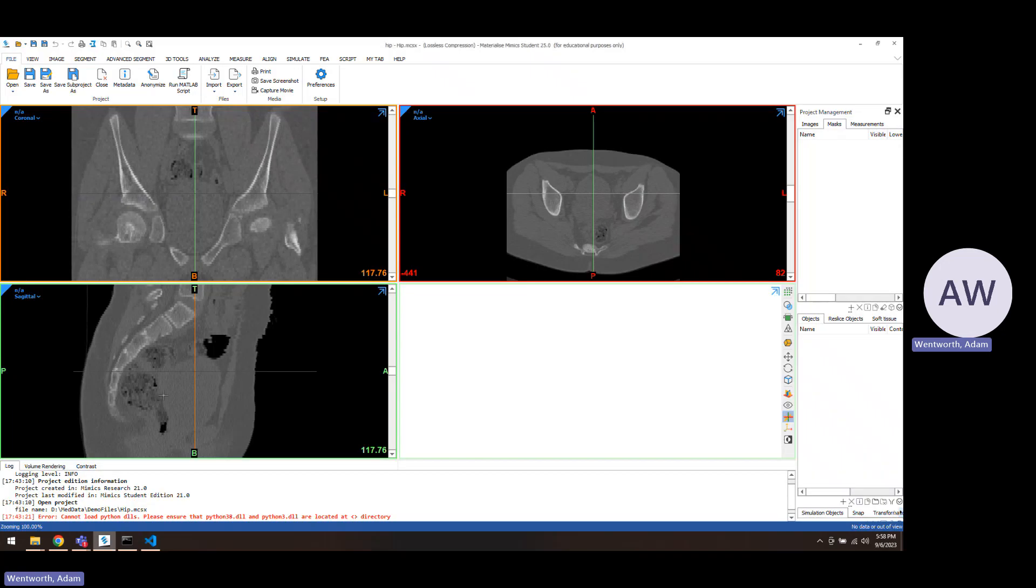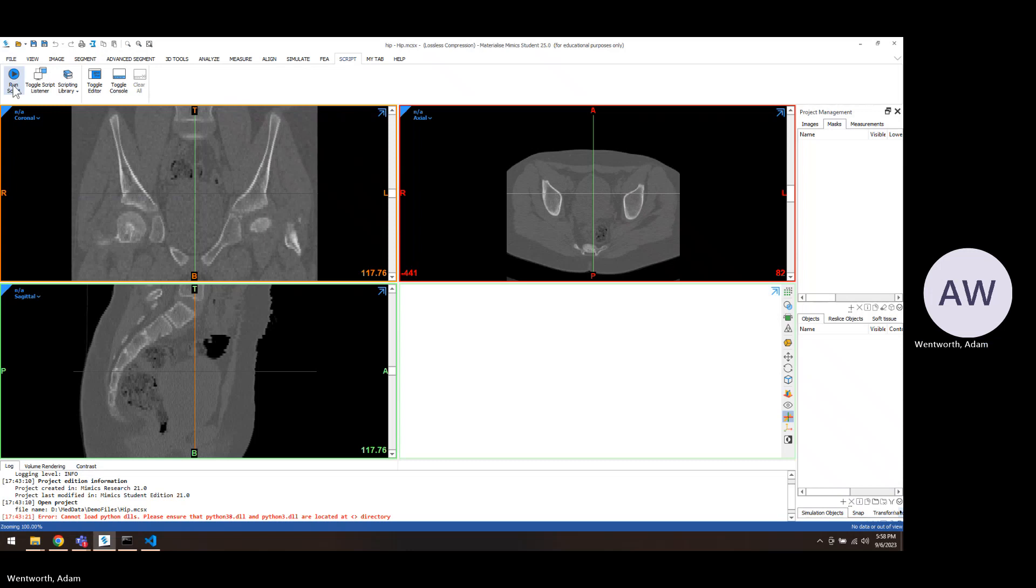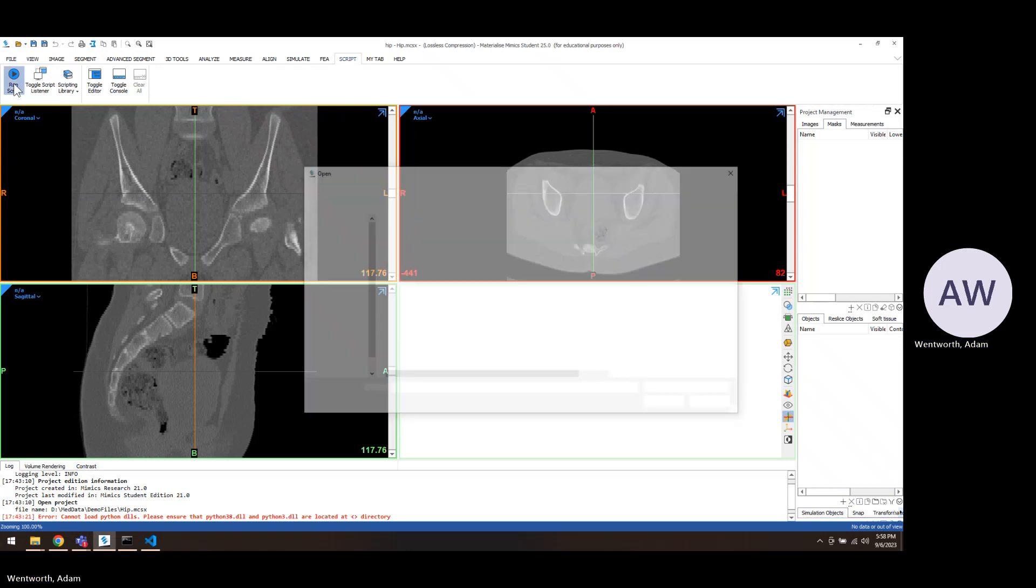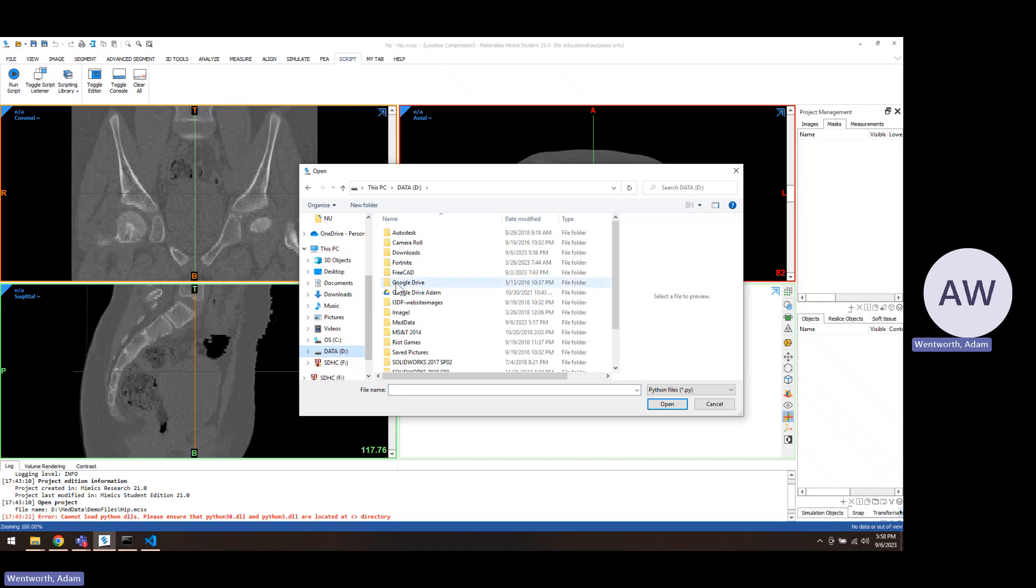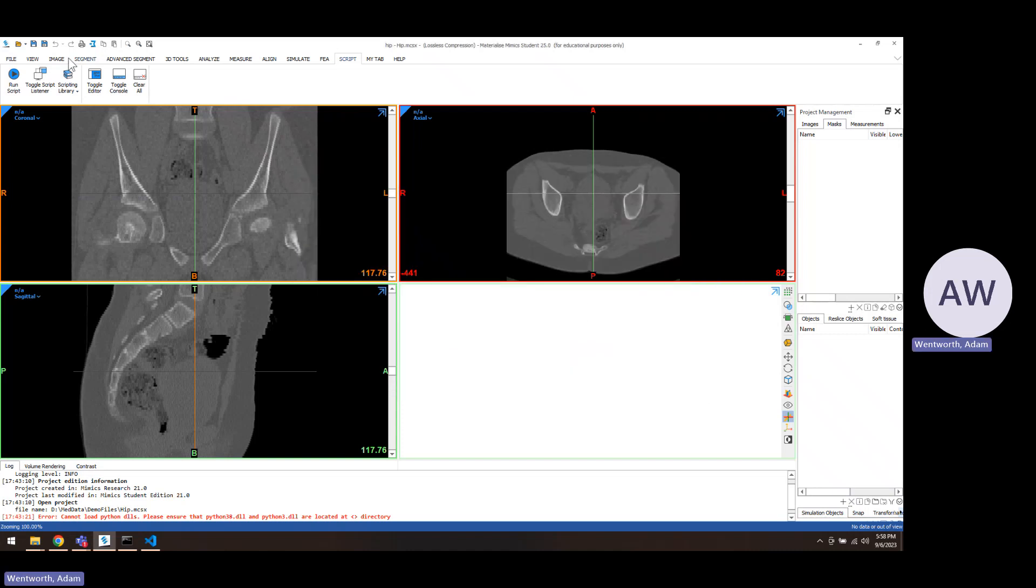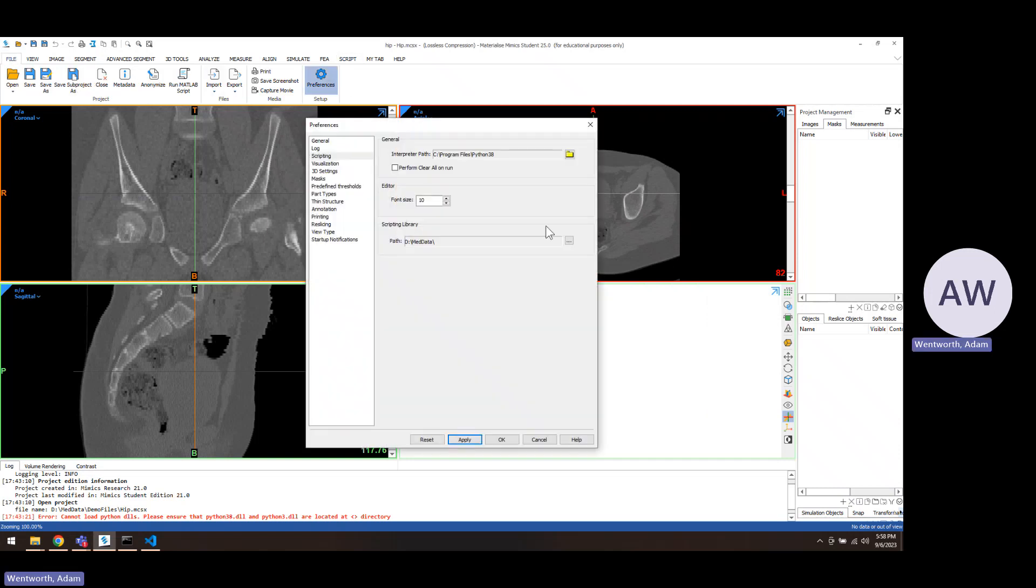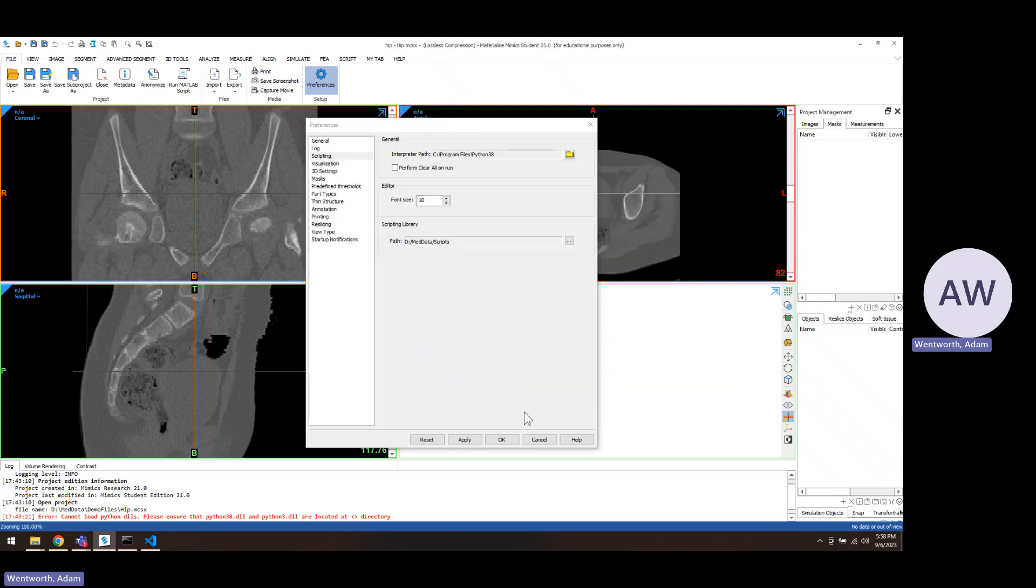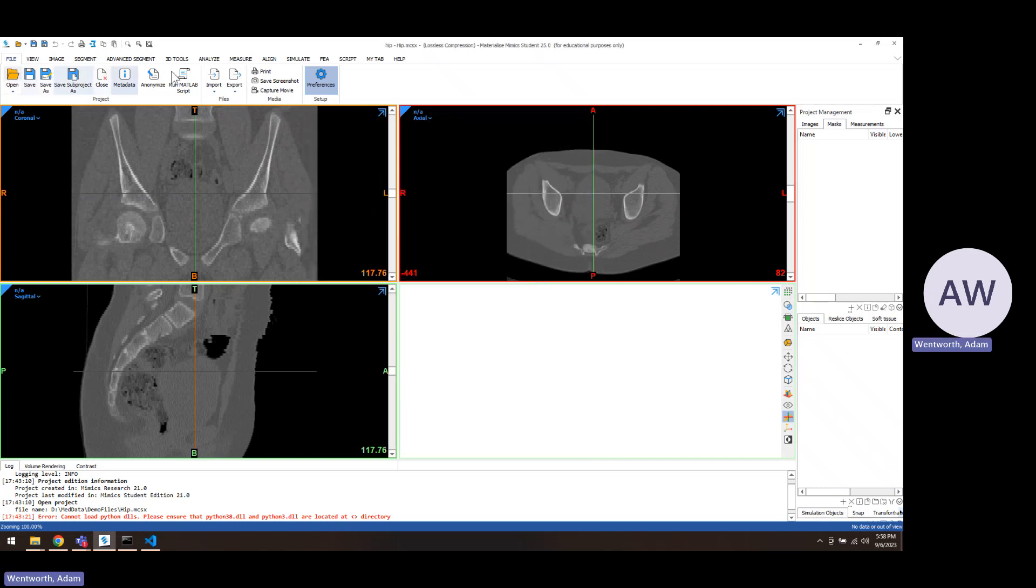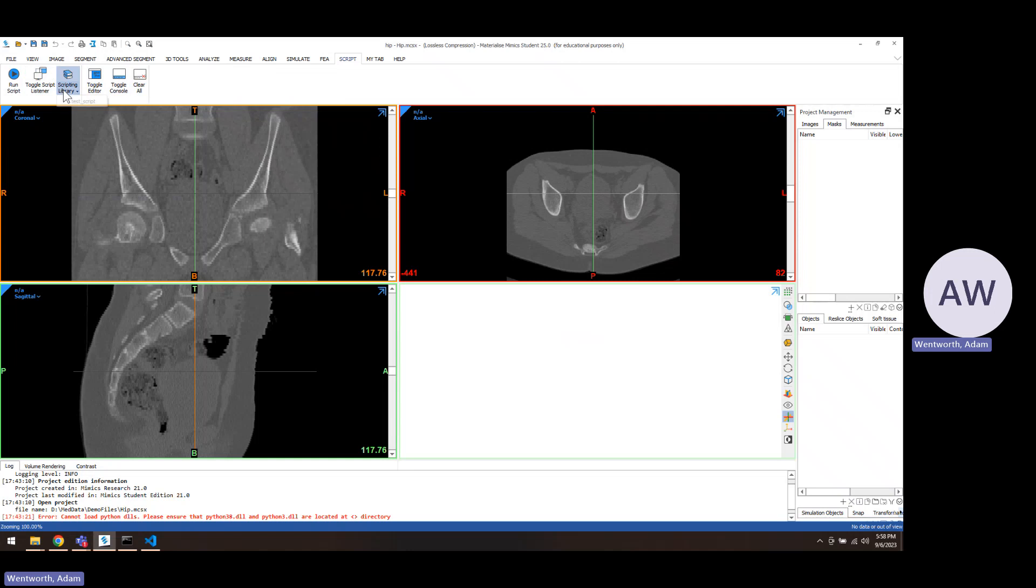If you're going to run a script, then there's a script tab at the top of Mimics. You can click Run Script and then you just navigate to that folder. You can just select the folder and then you can access those directly from this little scripting library down arrow, so you can run it right from there.